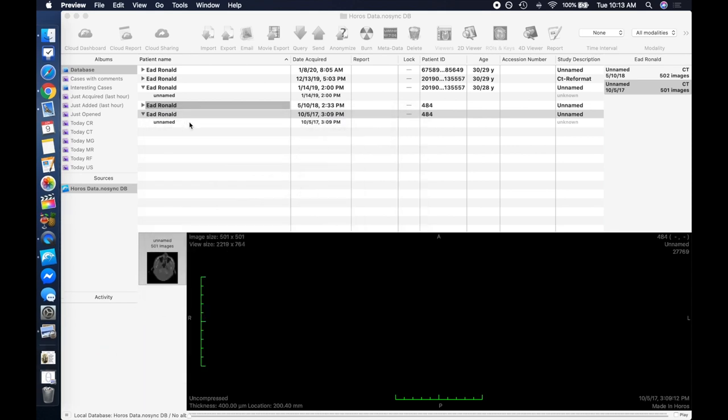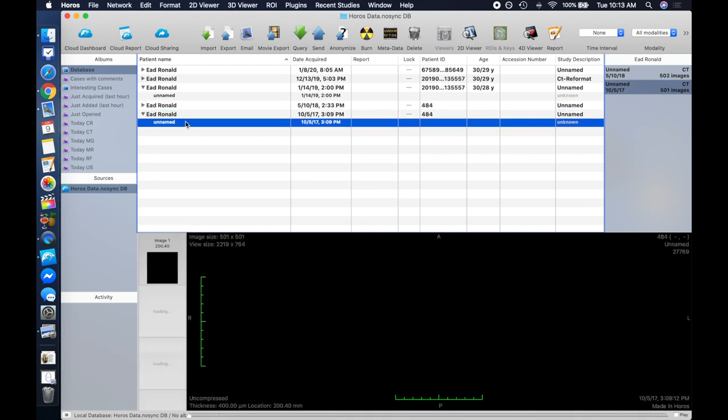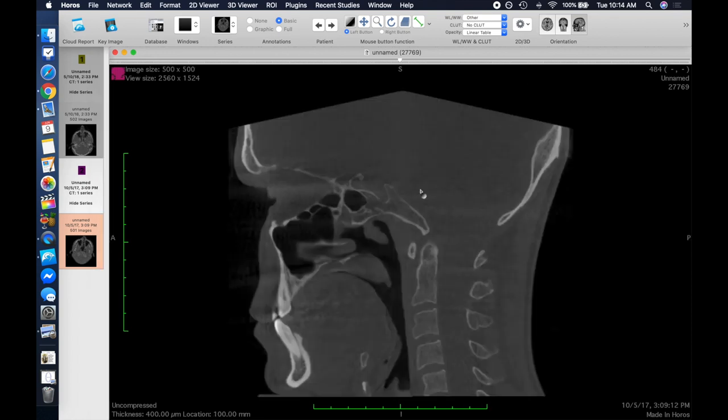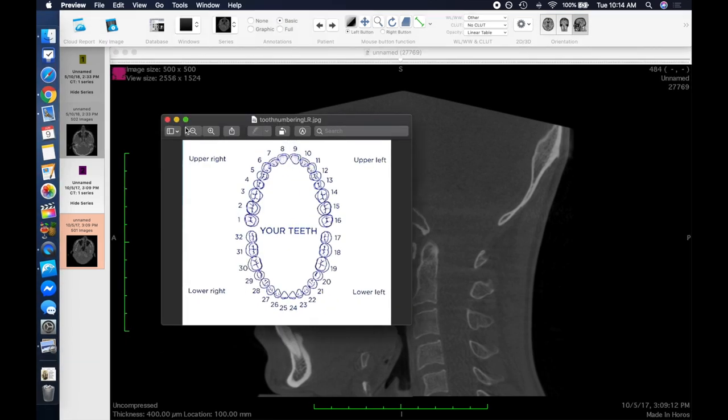So I'm opening up the CBCT from October 5th, 2017, about 10 days or so before AGGA was placed. This is the before CBCT for AGGA, the one that you could use to reference how AGGA changed the bone structure and the teeth in my face. So this is before AGGA. Now we're going to start with tooth number 10, the upper left tooth.